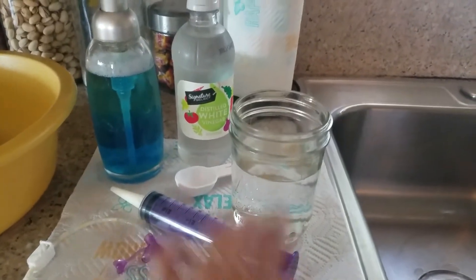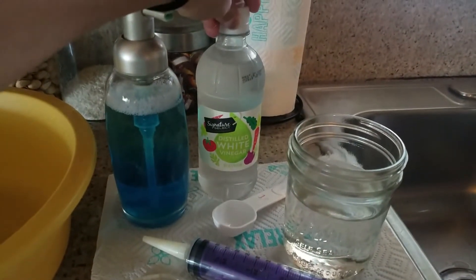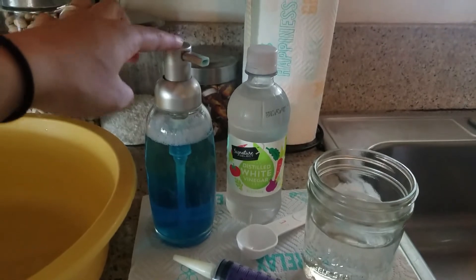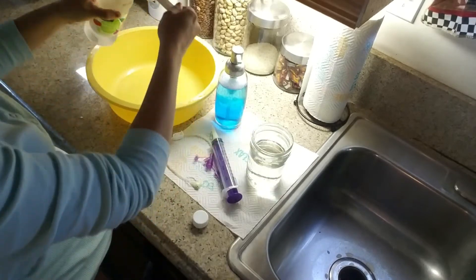All you need is a syringe, two cups of water, one tablespoon of distilled white vinegar, and just one small pump of Dawn soap. Let me show you how it's done.